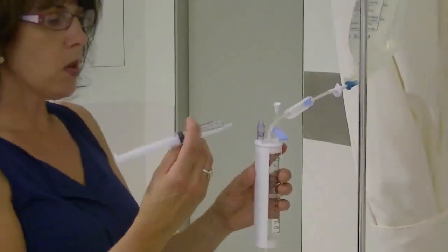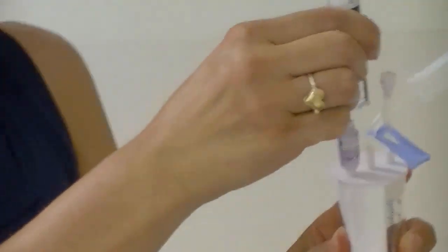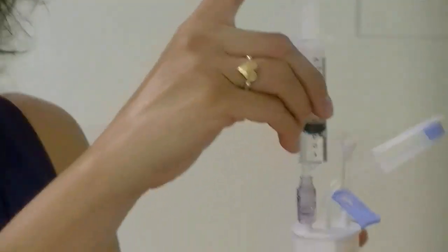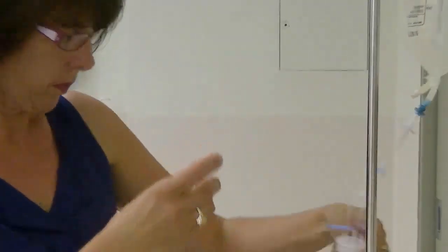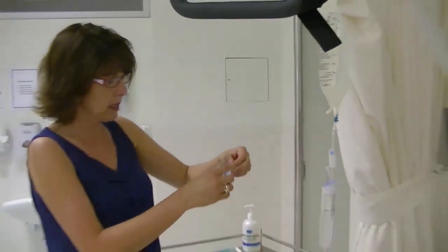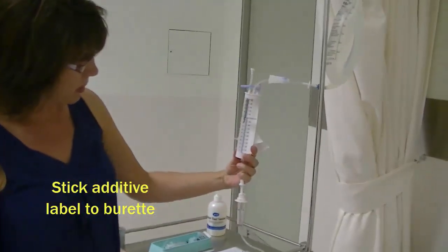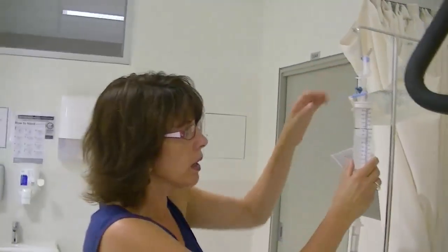You do not need a needle to access this port, so you just gently push the syringe down, give it a little twist, and inject the medication into the burette. Now that there is a drug in there, I will put my sticky label on to alert others to it. I note that I've got approximately 80 mils of fluid in the burette. I'll just hang it a little bit higher.